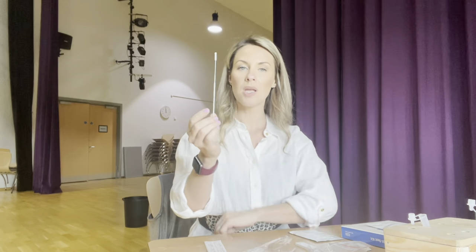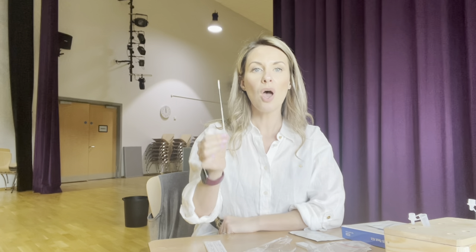Pop the packaging in the bin. You're going to swab the back of your throat for 10 seconds either side. You will have done this in school. Really wide mouth, avoiding your tongue, avoiding your teeth, avoiding the sides of your cheeks — you're aiming for your tonsils. Do your right tonsil for 10 seconds, and then your left tonsil for 10 seconds.